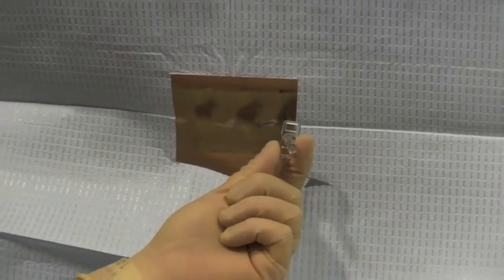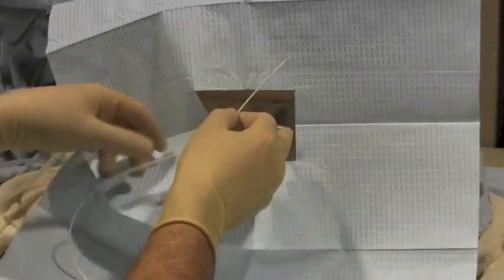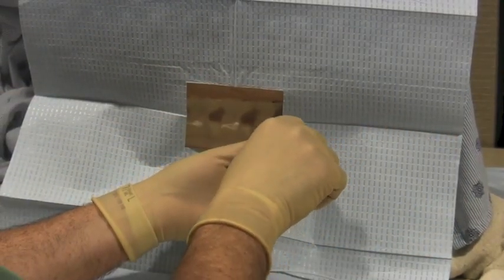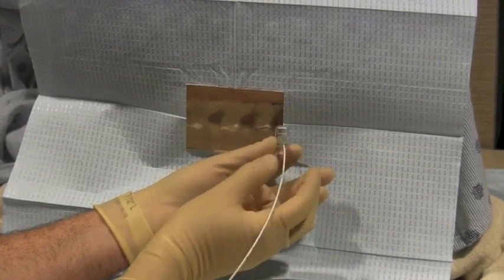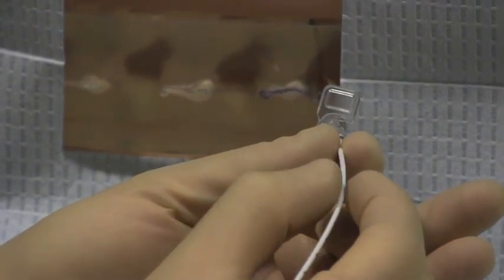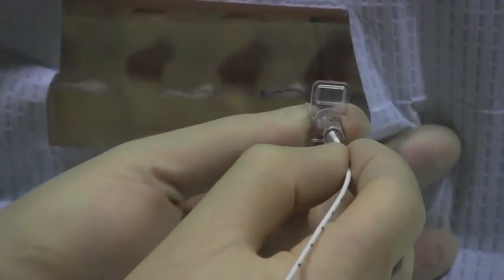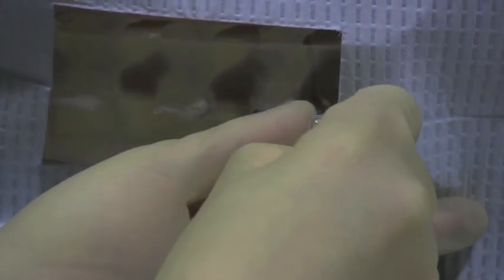Here we are removing the stylet. The bevel is pointing upward towards the head in the thecal sac. The catheter will now gently be advanced through the needle and directed into the thecal sac, and will hopefully be directed rostrally towards the head. Catheter is held in place as the needle is removed.